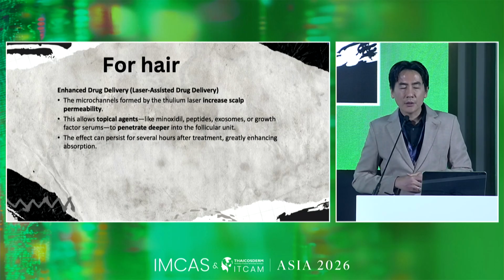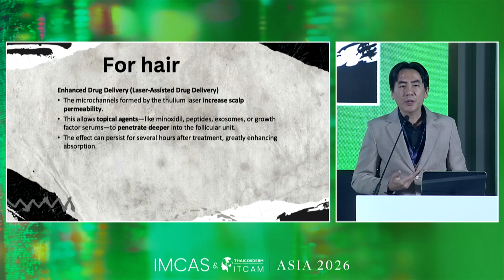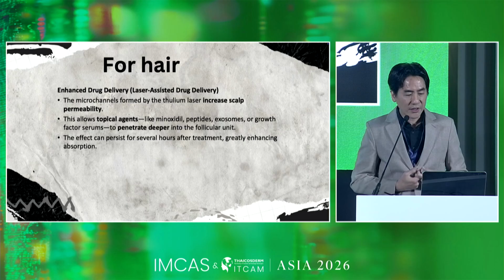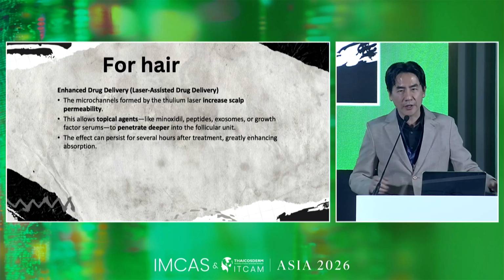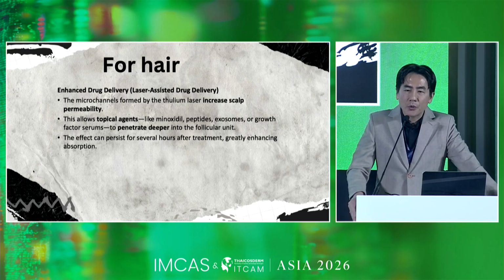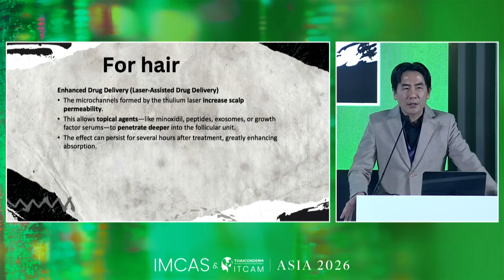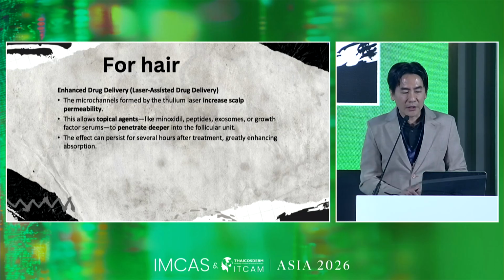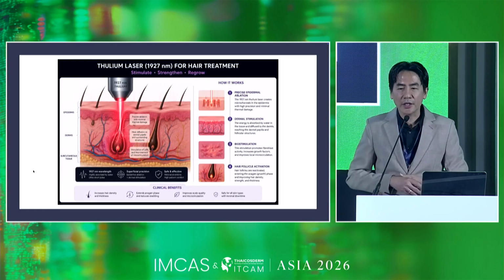And the most important thing is, normally we always give topicals to our patients, for example minoxidil, peptides, exosomes, or any growth factors. The keratin in our scalp is quite thick, that's why the topical product is quite hard to penetrate into the hair follicles. Using the thulium laser, I can help the product to penetrate deeper. So that's why this is quite good for hair treatment.